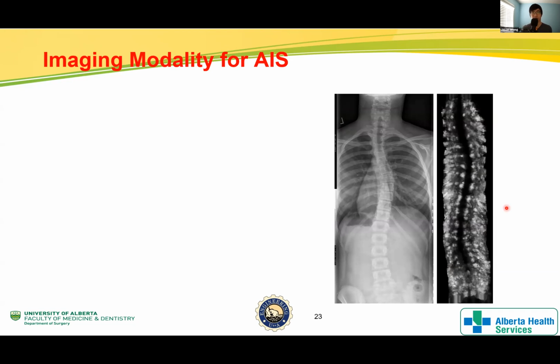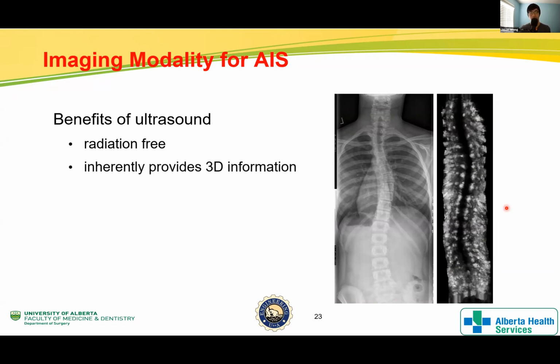From a clinical perspective, there are really three major factors that come into play when trying to decide between the two modalities. The biggest one, which Dr. Lau also went over, is that ultrasound is radiation free. One study found that women who were diagnosed with scoliosis as children were found to have a 70% excess risk of dying from breast cancer due to all of the radiographs they underwent. So we really want to minimize the radiation exposure because it clearly has an impact.